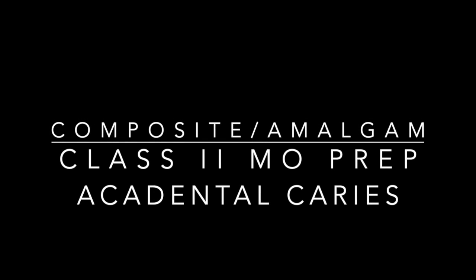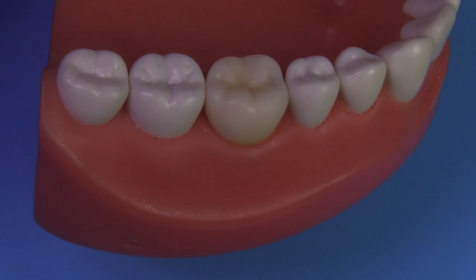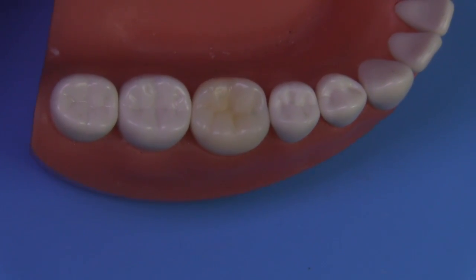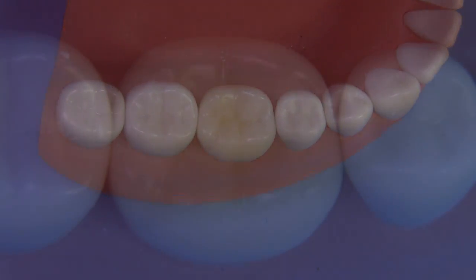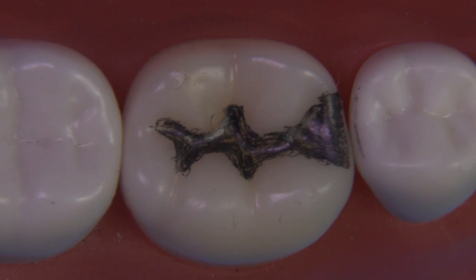Today we're going to discuss the composite and amalgam preparation on the Acadental tooth number 30. This is one of these caries teeth that you'll be presented with at the ADEX exam, the CDCA examination — very similar to this. It will have caries on the mesial, and you'll need to produce a preparation that removes the decay and follows all the requirements for a class 2.